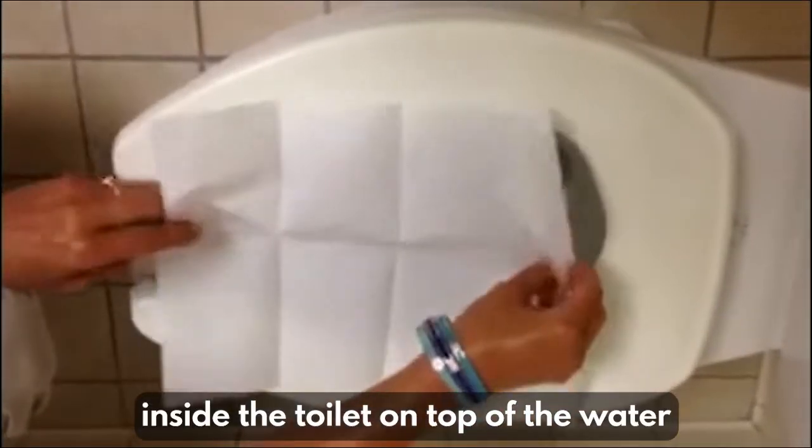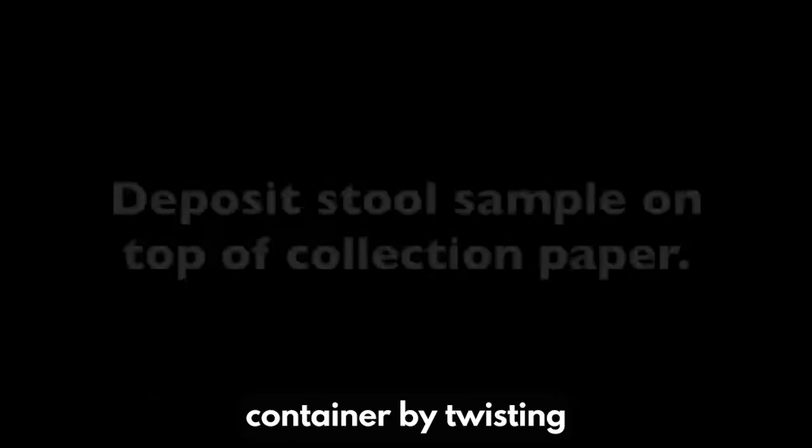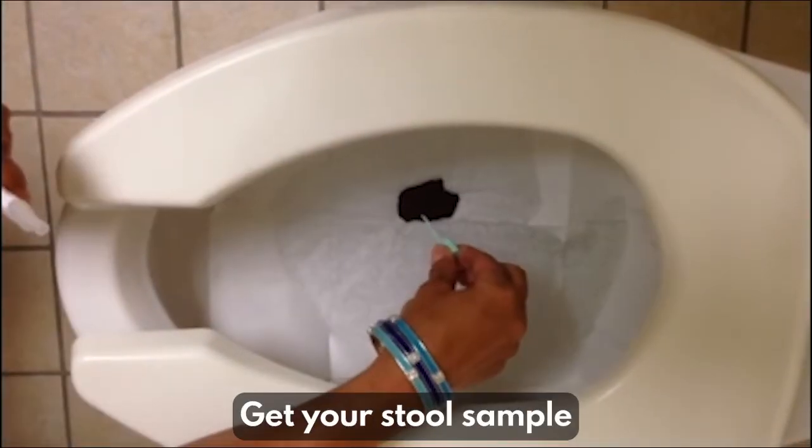Put the collection paper inside the toilet on top of the water. Deposit stool on top of the paper. Open the collection container by twisting and pulling the green cap. Get your stool sample.